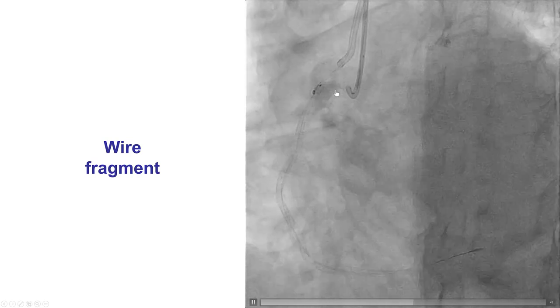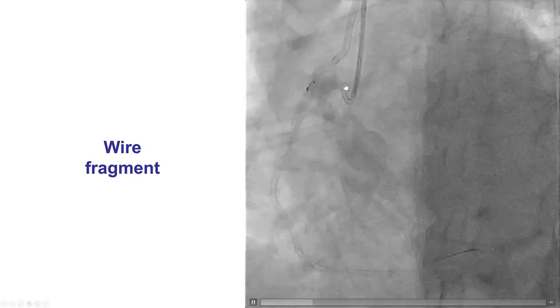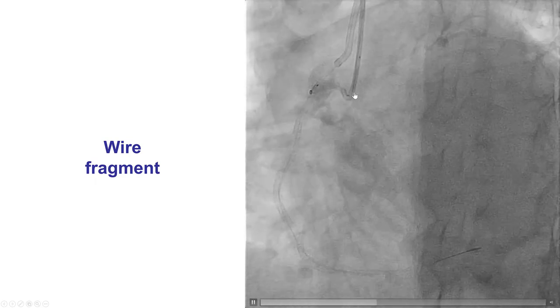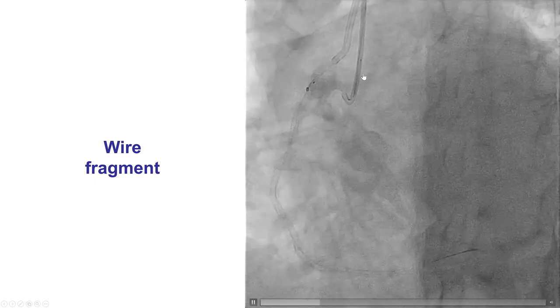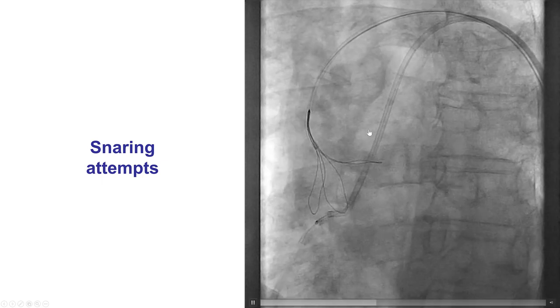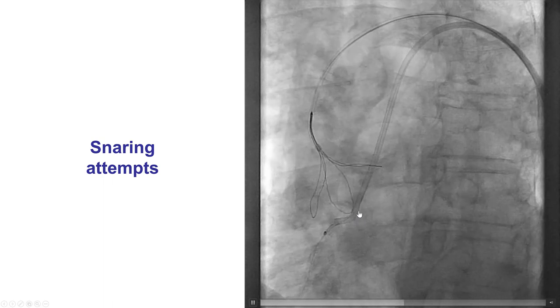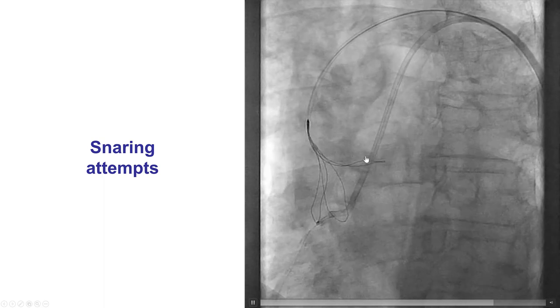Despite multiple attempts, we were unable to get the wire out. As a last attempt, a balloon was inserted into the guide catheter that had the entrapped wire. It was inflated and then pulled back vigorously in an attempt to break it, and indeed the wire broke. But unfortunately, we now have a part of the wire out in the aorta, which we can see intermittently in some of the frames.